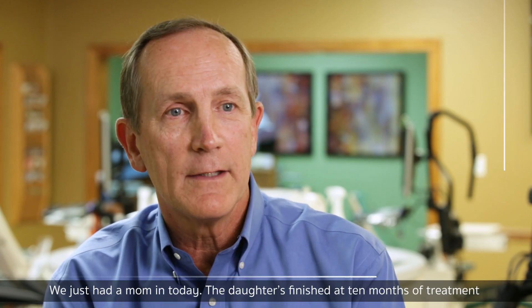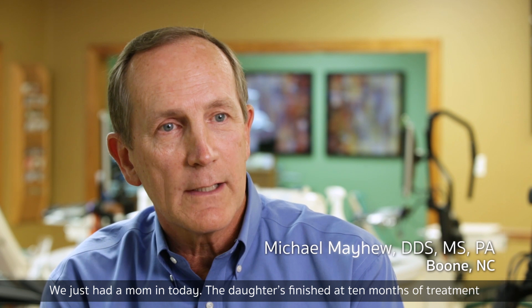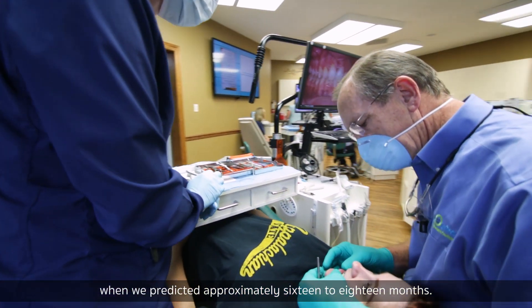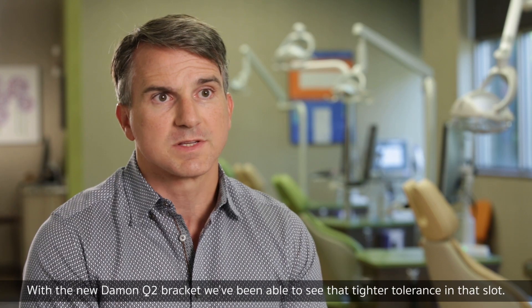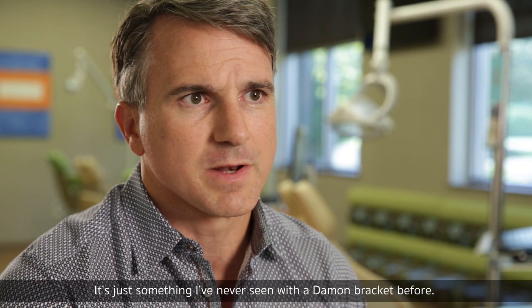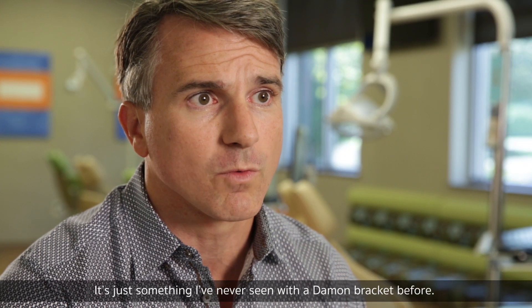We just had a mom in today — her daughter finished at 10 months of treatment when we predicted approximately 16 to 18 months. With the new Q2 bracket, we've been able to see that tighter tolerance in that slot. It's just something I've never seen with a bracket before.